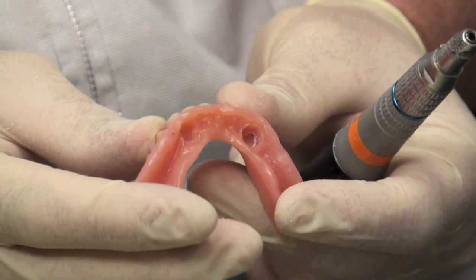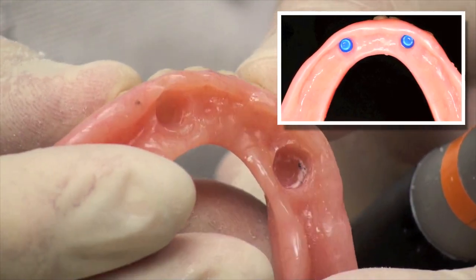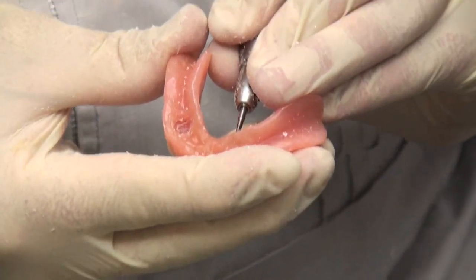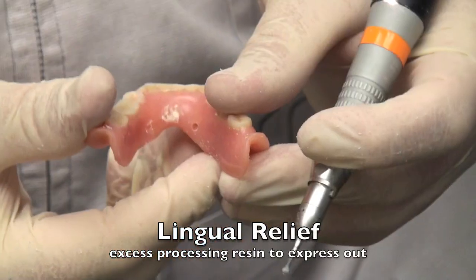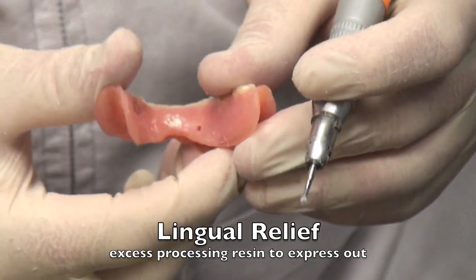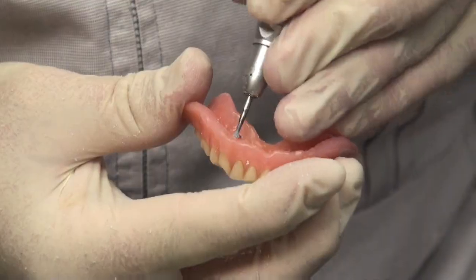Locators are metal studs that get attached to implants and they're made for different implant systems. What you do is place some metal housing into the denture, providing a space for these housings. Then a plastic resilient cap will be snapping inside of the metal housing. To add the metal housing you need a space, but also a little relief point at the lingual side of the denture so that the resin can get expressed out as you put this back in.